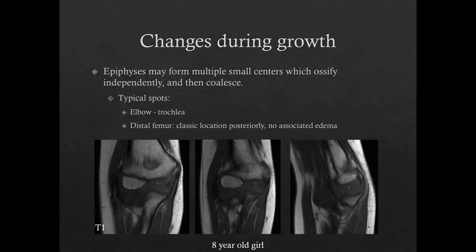Some epiphyses ossify by forming multiple small centers, which may have a fragmented appearance. During growth, these multiple small centers coalesce and fuse together, finally becoming one epiphyseal center. Typical spots where this occurs are the trochlea in the elbow, as in this 8-year-old girl, and the distal femur. You should not see any high T2 signal edema in these circumstances.